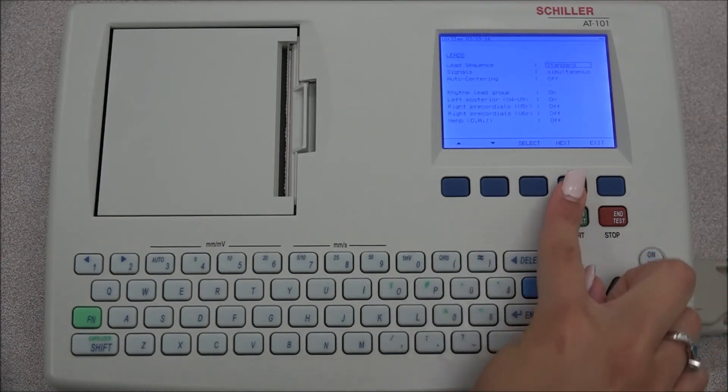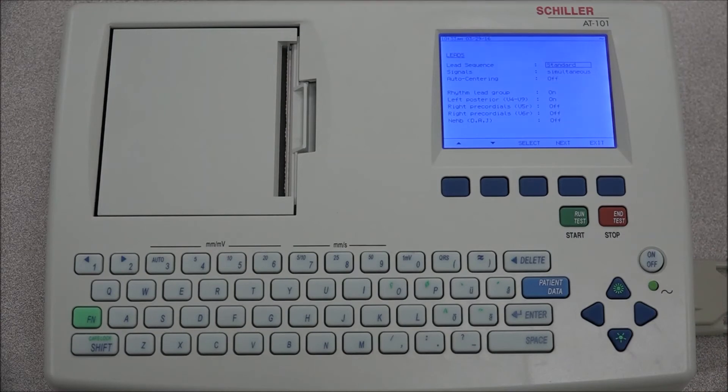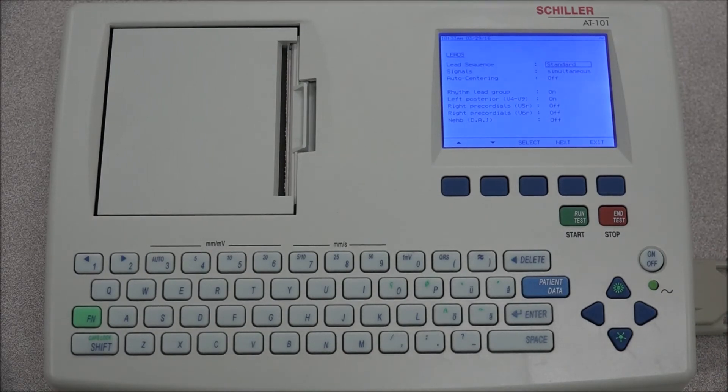Under the leads tab, the lead sequence can be selected, as well as defining the type of signal. The auto-centering can be turned on or off, as well as the rhythm lead group.